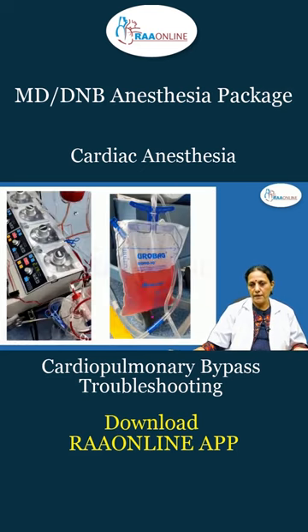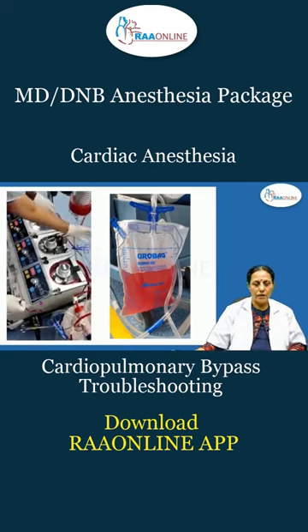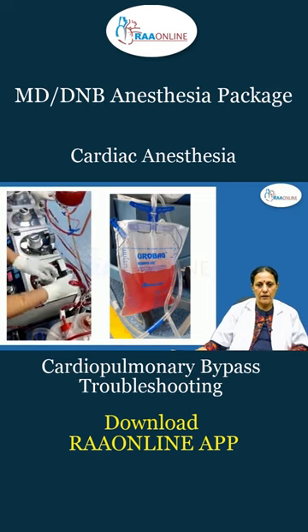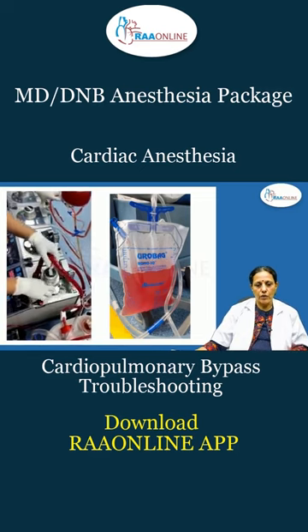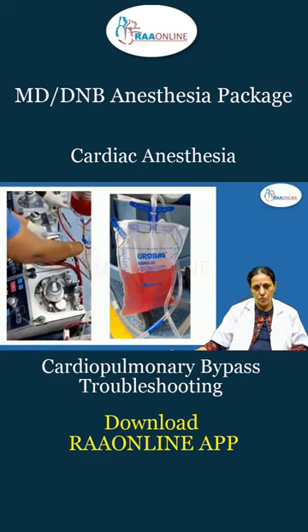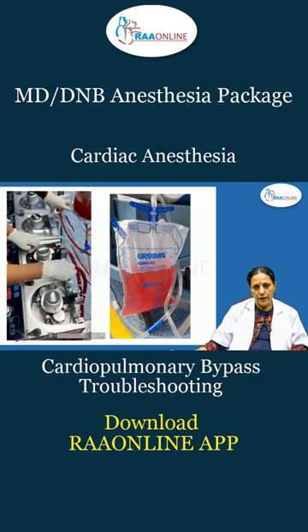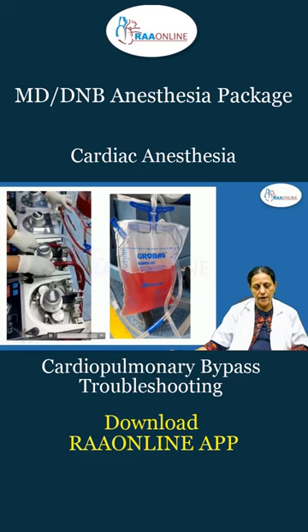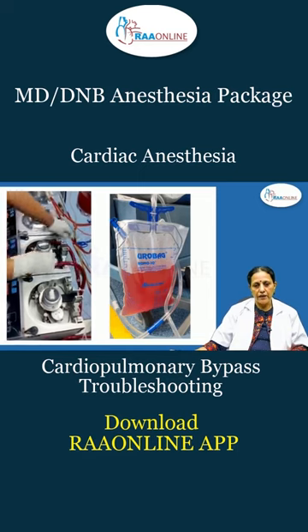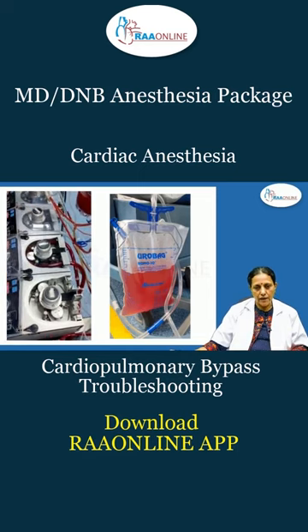You need a strong person to lift and replace the pump. Here, the pump is running — I want to show that this pump has stopped now. I am taking out whatever tubing is there. This is the arterial pump. This is how it should be quickly done — replacing the pump.